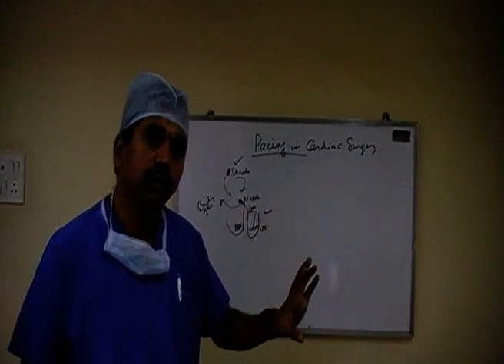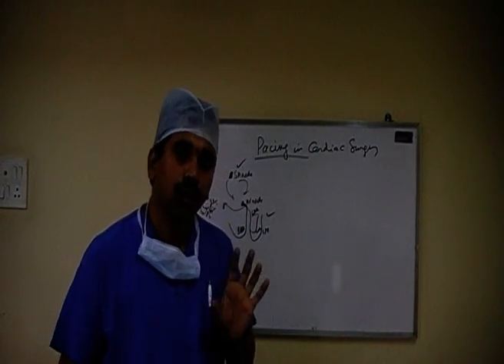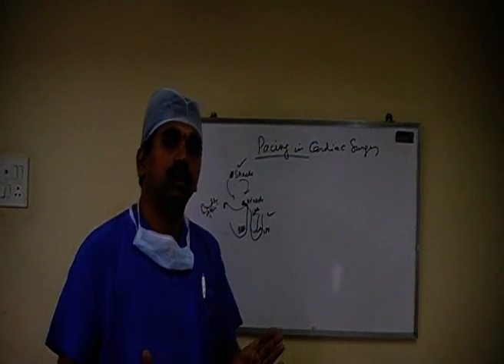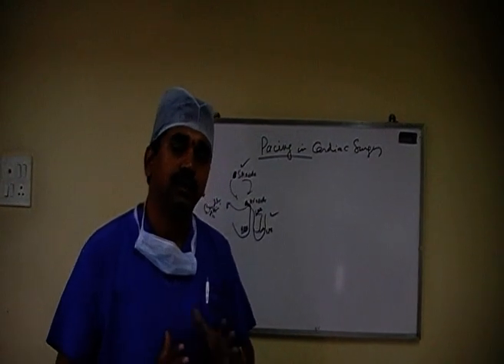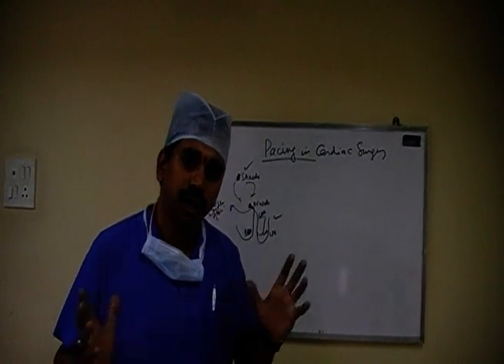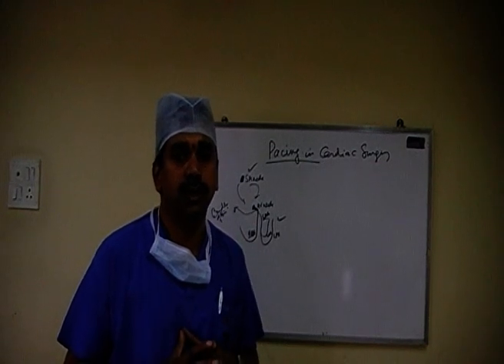So at least monitor for 24 hours before you plan taking pacing wires out, and also get an ECG done off pacing so that you can record that the patient is in sinus rhythm before taking the pacing wires out. If the rhythm is not sinus, if there are episodes of bradycardia, if there are any other concerns, please consult your senior before you consider taking the pacing wires out.